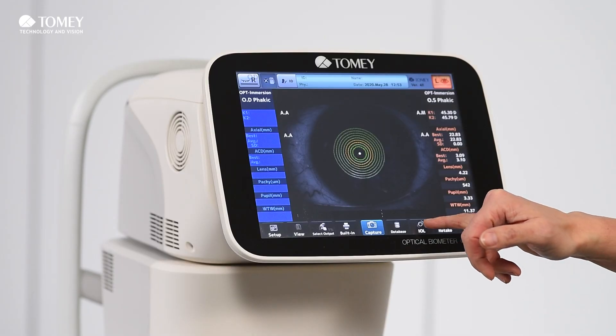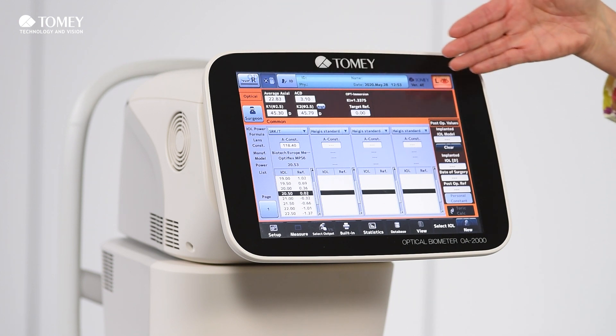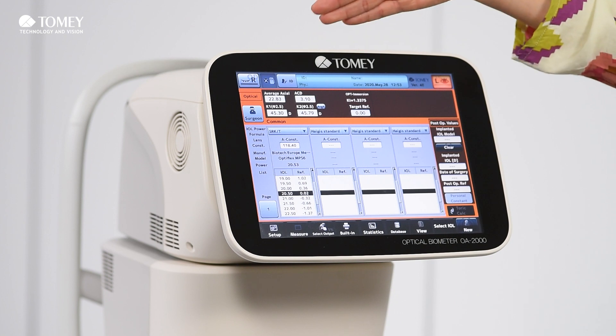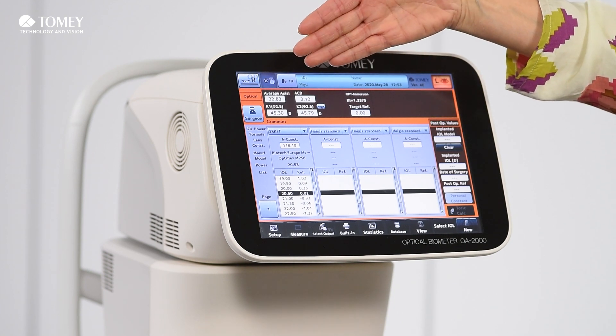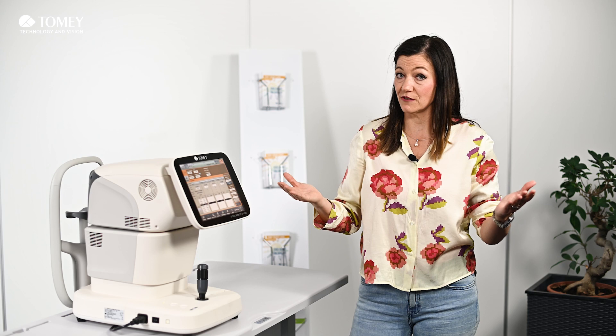After taking this measurement, you simply click on the IOL button and then you get an overview of everything. You get your average axial length readings, your ACD, the K-readings of course, and you need to enter your target refraction. The target refraction is up to you, so it's very individual, and then you get a full calculation.